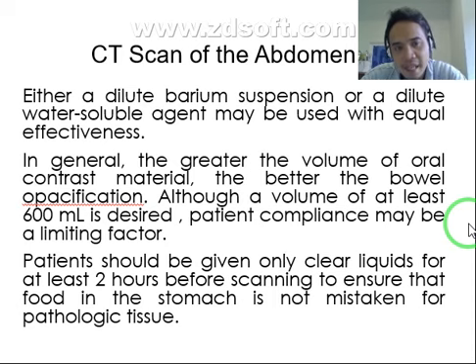But the problem is, pag water-soluble atong gamiton, it is highly absorbable sa atong intestine. So, dali lang siya ma-absorb. But again, it is used to evaluate mga ruptures, mga perforations sa atong intestine, mga buslot. Okay, na mga samad, pwede na gamitan ng water soluble.